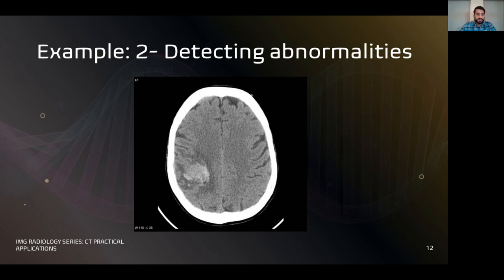And it's got an irregular border. And around it is some hypoattenuation in comparison to the mass. That hypoattenuation represents a bit of swelling or edema, essentially. If it grows even darker, it might even represent some blood. But really, I think at this point, it just represents some edema. So you know that there's something wrong here, and this is essentially a brain tumor.